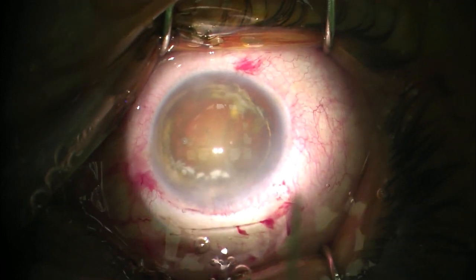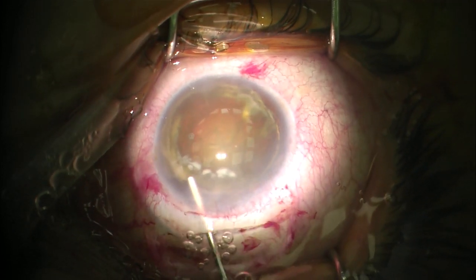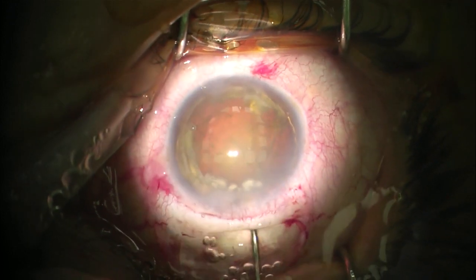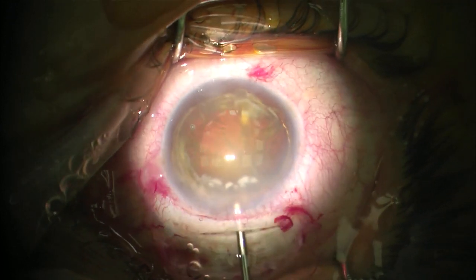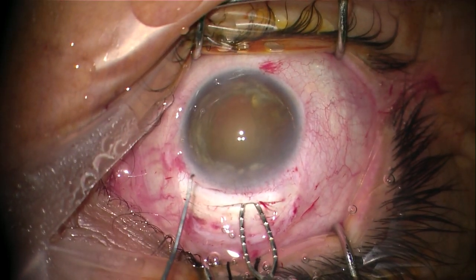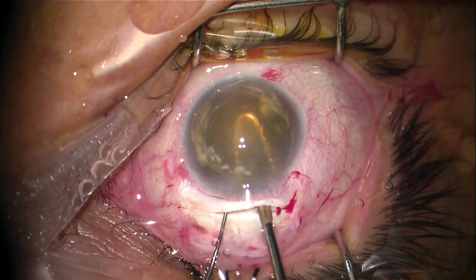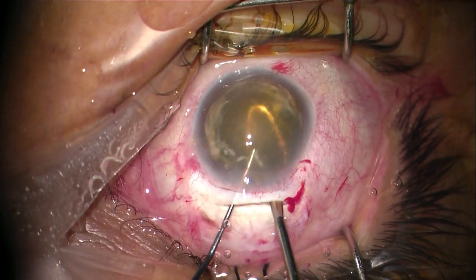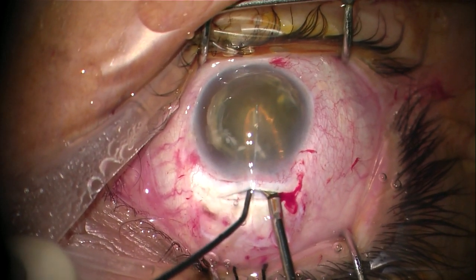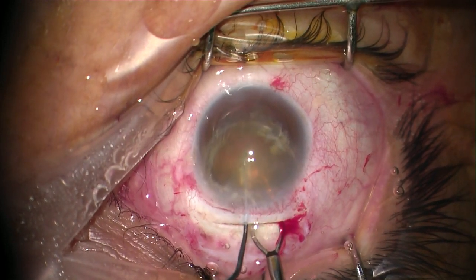Viscoelastic is injected above the nucleus to protect the endothelium of the cornea and below the nucleus to push it down. To deliver the nucleus out of the eye, we go with a scoop under the nucleus and the Sinskey hook above it — we grasp the nucleus and take it out through the tunnel. At this step, we should keep an eye on the inferior iris as it might get caught with the nucleus, which can cause iris dialysis.